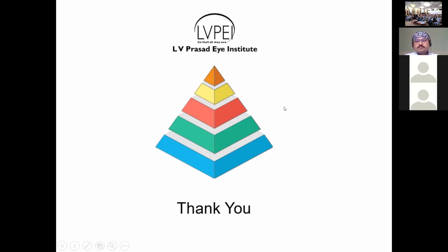Okay, thank you, Dr. Sharma, for this valuable lecture. But let me ask a question. Is visual field still important in the presence of OCT? Visual field will start to deteriorate only after deterioration of more than 40% of the optic nerve fibers, but OCT can detect this easily, earlier than visual field. So it's important, more important. My question is, will OCT replace visual field?